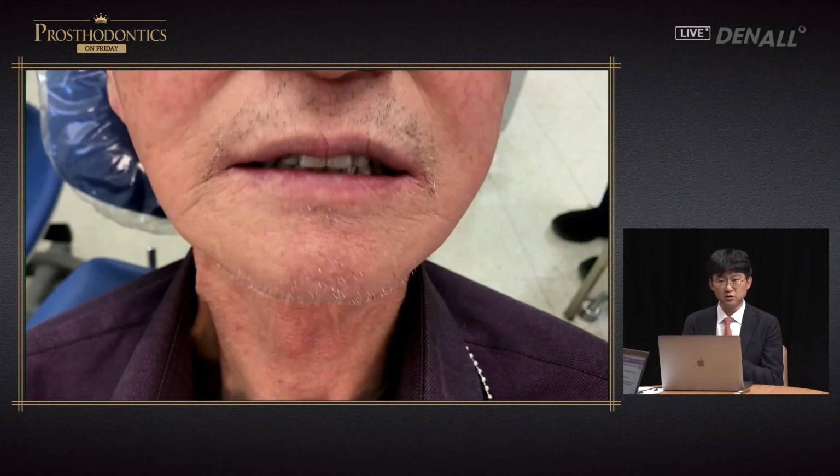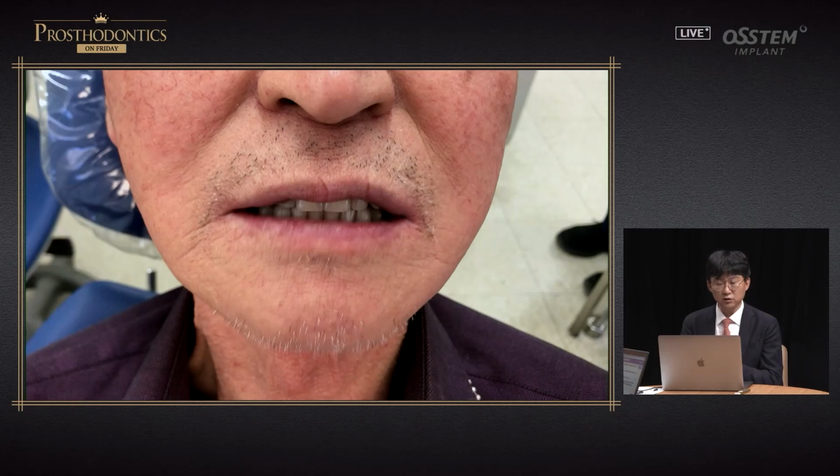So sometimes it is hard to find the textbook-like TMJ position in senior patients, and their lateral movements on an articulator do not match the intraoral movements, because an articulator is a machine to reproduce normal lateral movements of a patient. It is hard to control patients, so we do not know where the lateral movements would go. Rather than completely solving bilateral occlusion with that machine, we need to establish less than perfect occlusion, and it should be adjusted intraorally to match the balance.